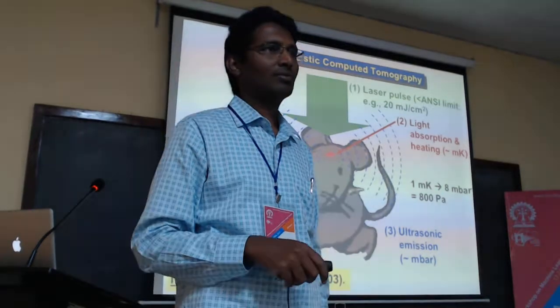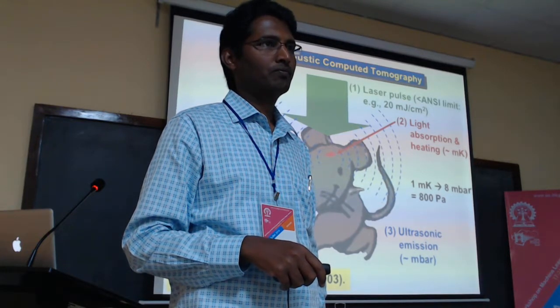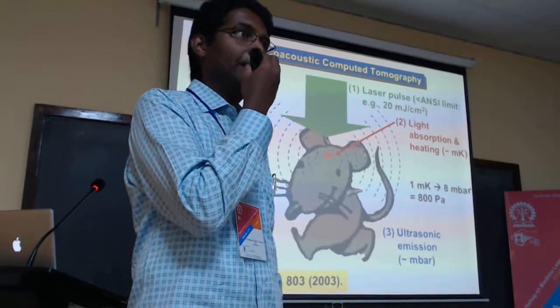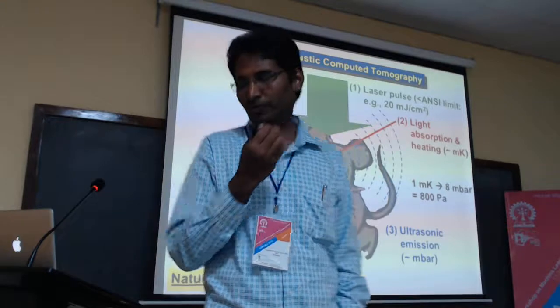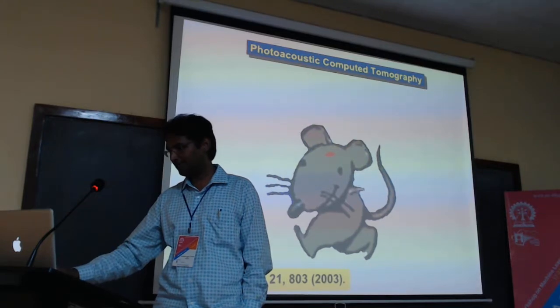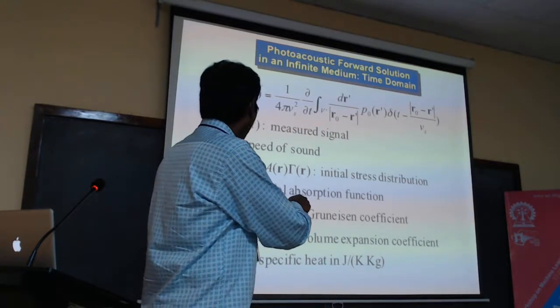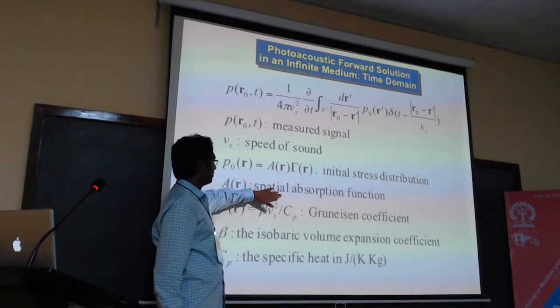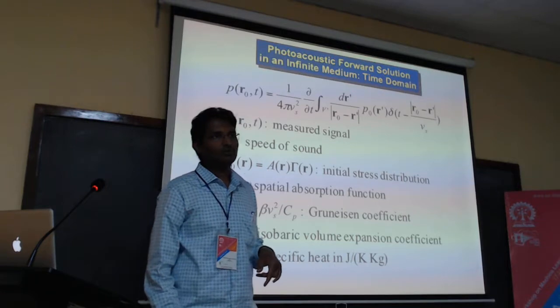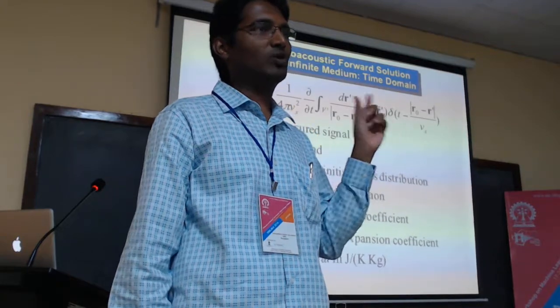Between the wavelength of the source, between the 350 nanometers. Yes, it is. We are told in terms of the equation. Okay, so that comes into this, right? Let me go back to that equation and then let me explain. This is where the absorption is. When we talk about the spatial absorption function, this A of r, which I have not put, it's actually A of r and lambda, spatial absorption plus wavelength absorption. It is dependent on the wavelength.